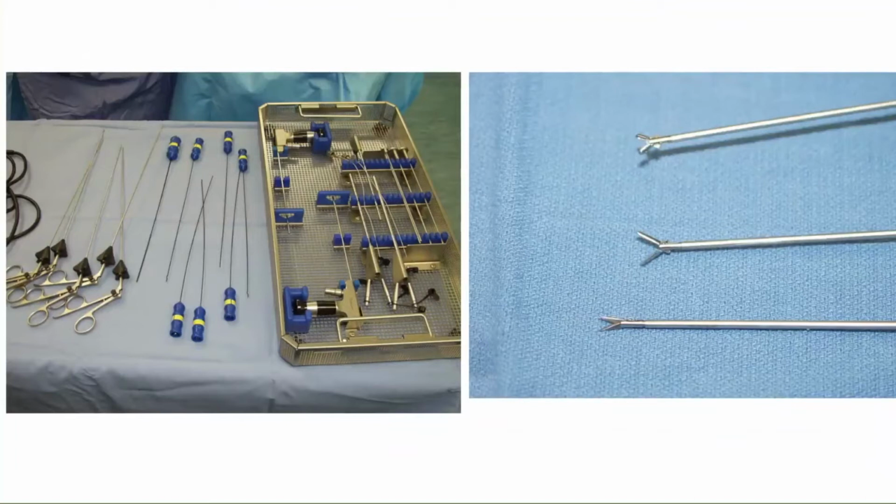Most of the rigid working instruments will have a function where you can rotate the angle or the axis of the surgical instrument, and that's really helpful so that you can maneuver the orientation in which you cut or dilate or do any particular maneuver. And this is basically a magnified close-up of some of the rigid instruments that we use.